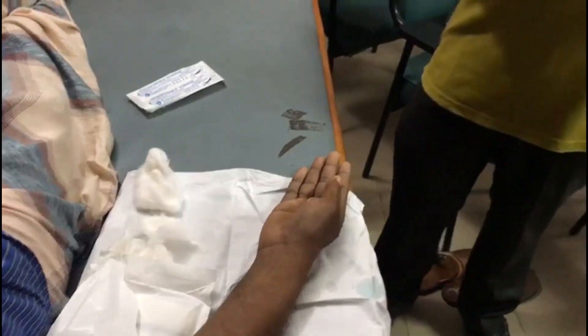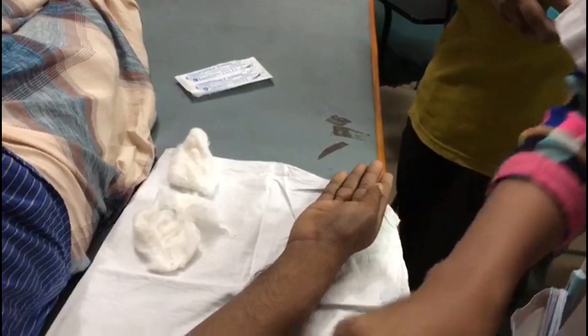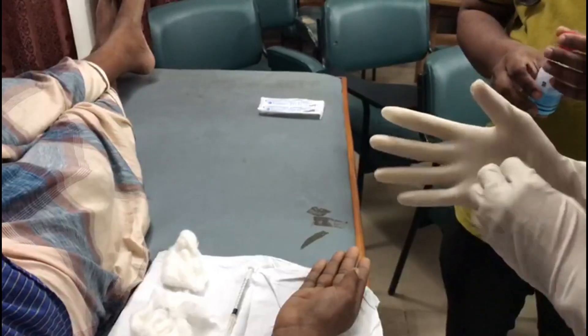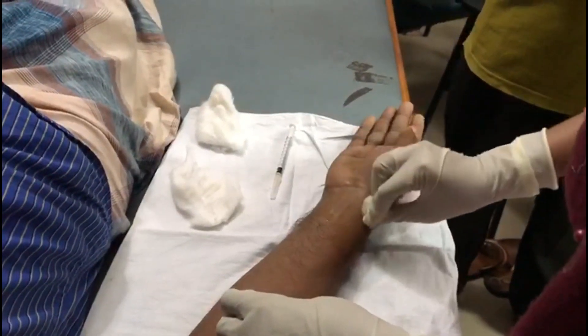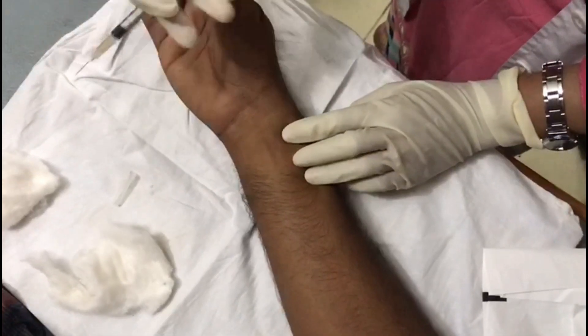To perform the procedure, first feel the radial pulse very carefully. After maintaining aseptic technique, wear your gloves. Then wash the area with chlorhexidine or povidone-iodine solution. Feel the pulse again, and when you feel it well, remove the middle finger.